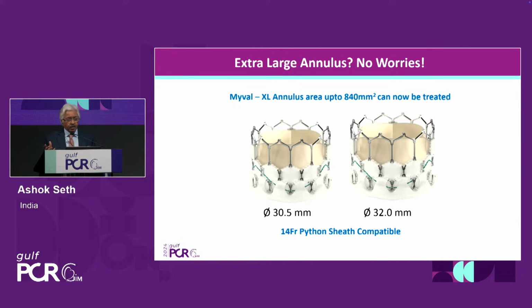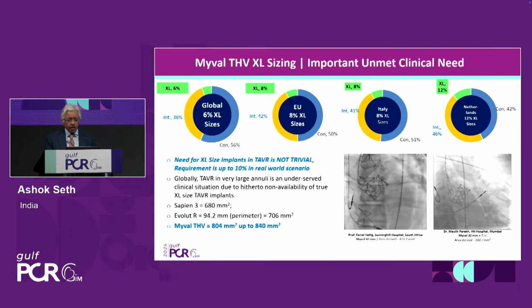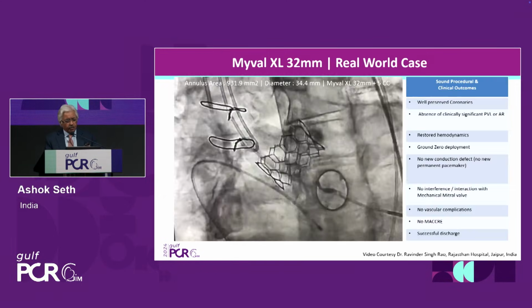Of course, the extra large size adds to this whole range, the 32 millimeter, which is compatible with the 14 French sheath. 7 to 10% of the valves across the world are extra large sizes being used.